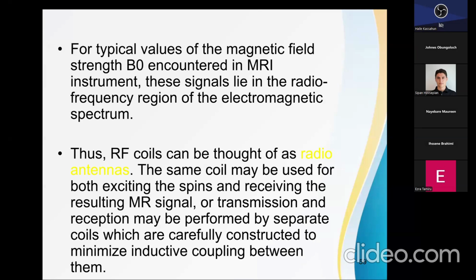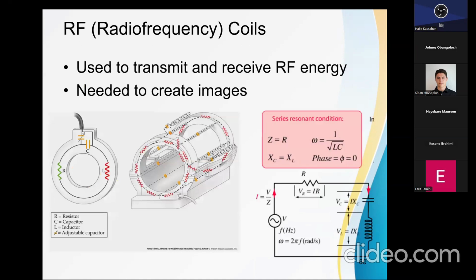So the circuitry that you build for controlling this system, as we were talking about the hardware in the beginning, we talked about the magnets, and we talked about the associated hardware that control these magnetic fields. So building circuits that run at these types of frequencies can be relatively difficult at 128 megahertz, 64 megahertz. In our case, about 2 megahertz that we run. So we have to have circuitry that do that.